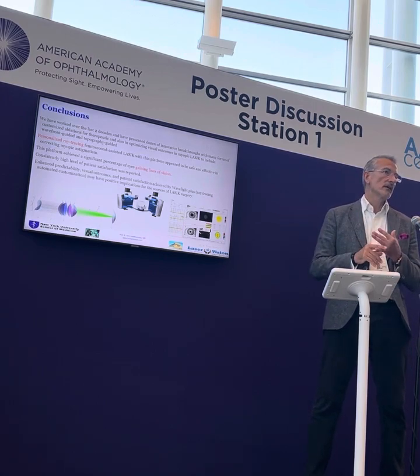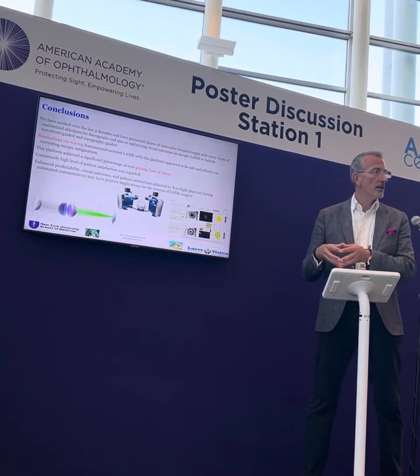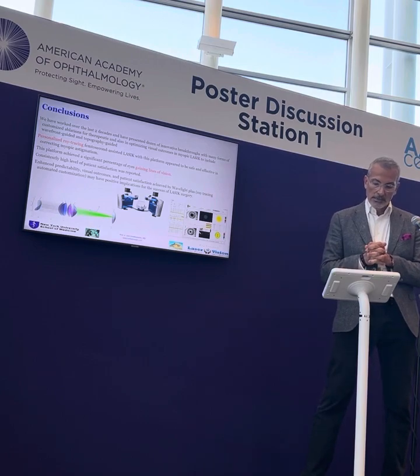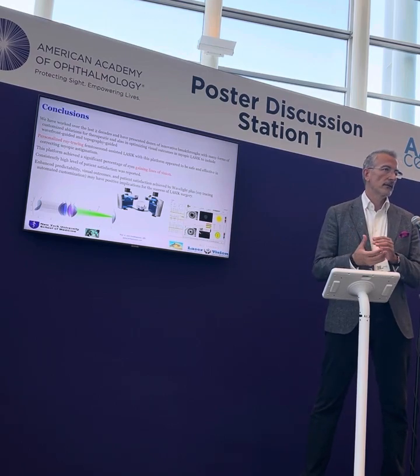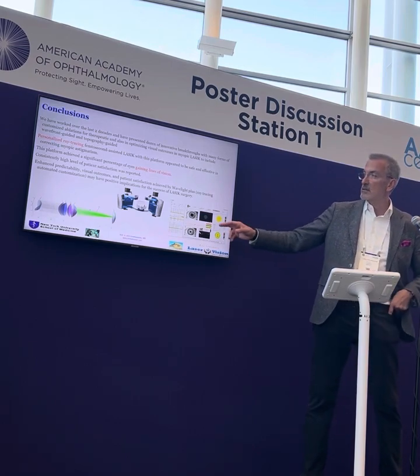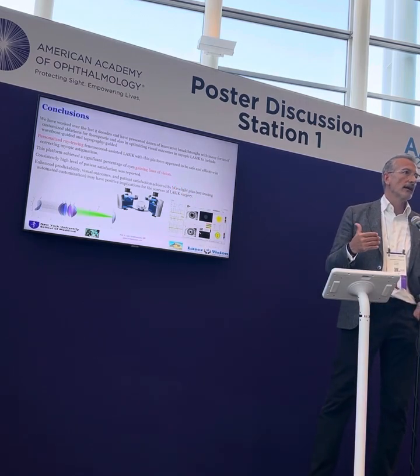that addresses lower aberrations in an automated way, so away from the manifest subjective refraction of patients, which has been the gold standard up till now. And it appears that along with correcting or attempting to correct higher order aberrations in lieu of coma, trefoil, and spherical aberration, it does give us the ability to have patients gain lines of vision.